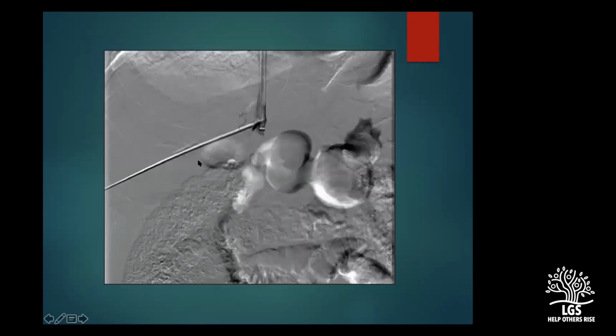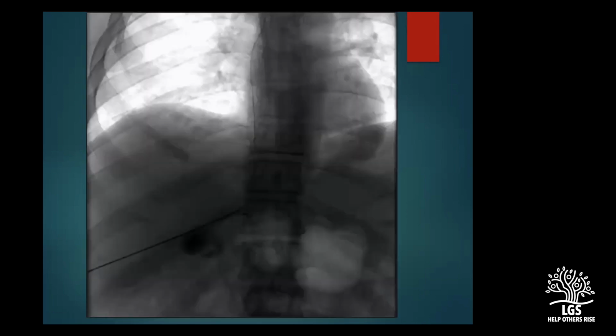And from the portal vein, the needle is passed all the way towards the cava, because we have a sheath from the jugular approach inside the cava. So we target the sheath and we aim for the cava from the portal vein towards the cava. And once we puncture the cava, the wire is let into the cava, which is retrieved from the top end, into the IJV.